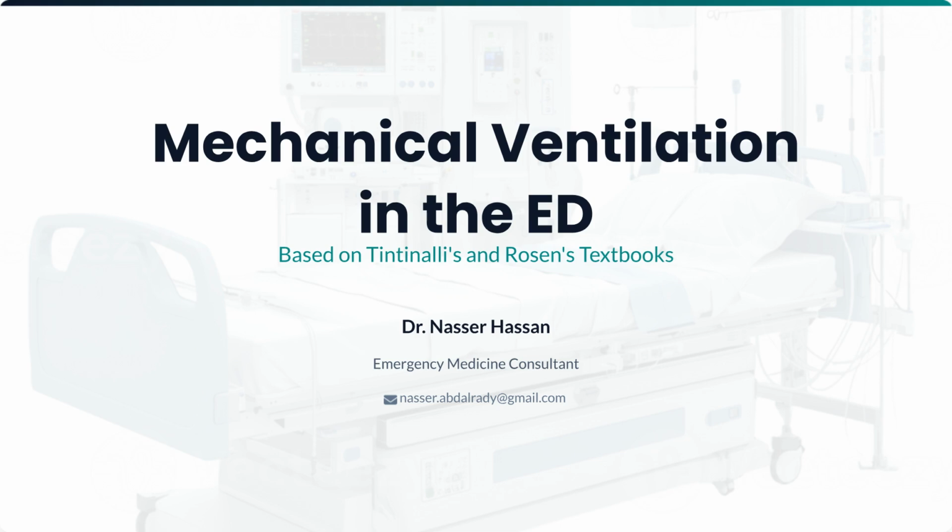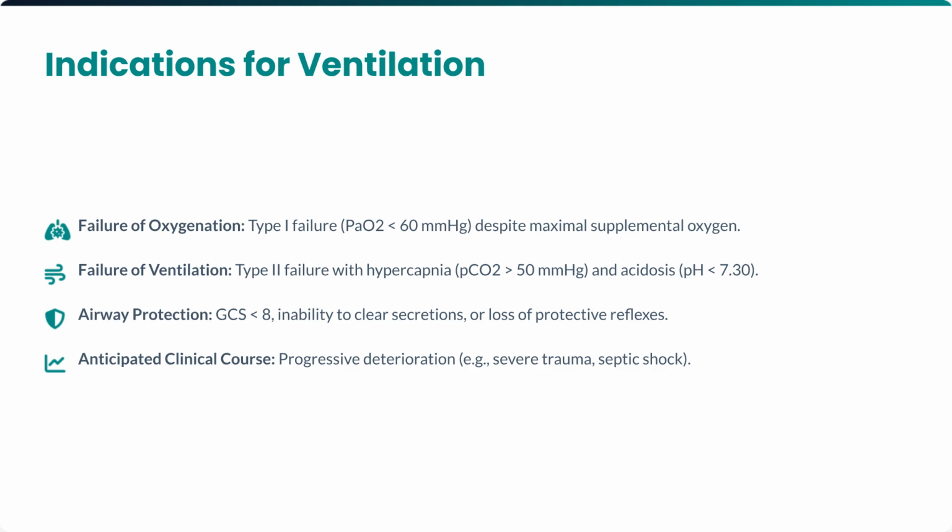Welcome to this video on mechanical ventilation in the emergency department, based on key emergency medicine textbooks. Indications for ventilation include failure of oxygenation, failure of ventilation, need for airway protection, and anticipation of a deteriorating clinical course, such as in severe trauma or septic shock.